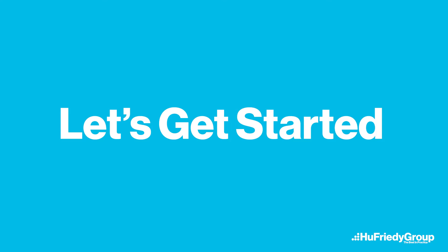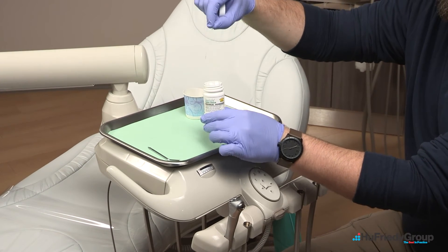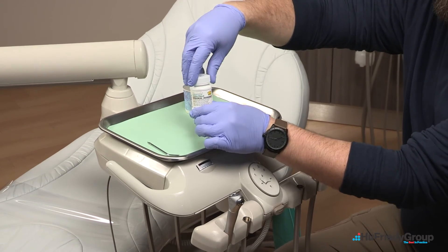Let's get started with the test strip procedure. To begin, perform a two minute flush of all the lines on the unit connected to water. Remove one test strip from the bottle and reseal the bottle to maintain freshness of the other test strips.